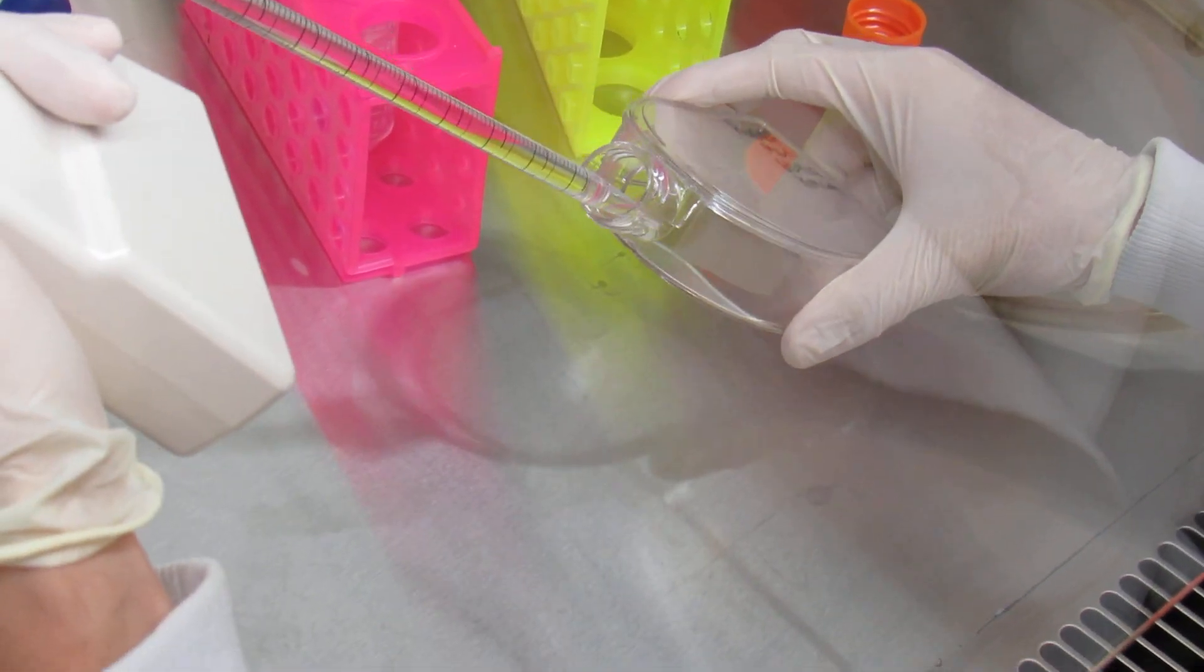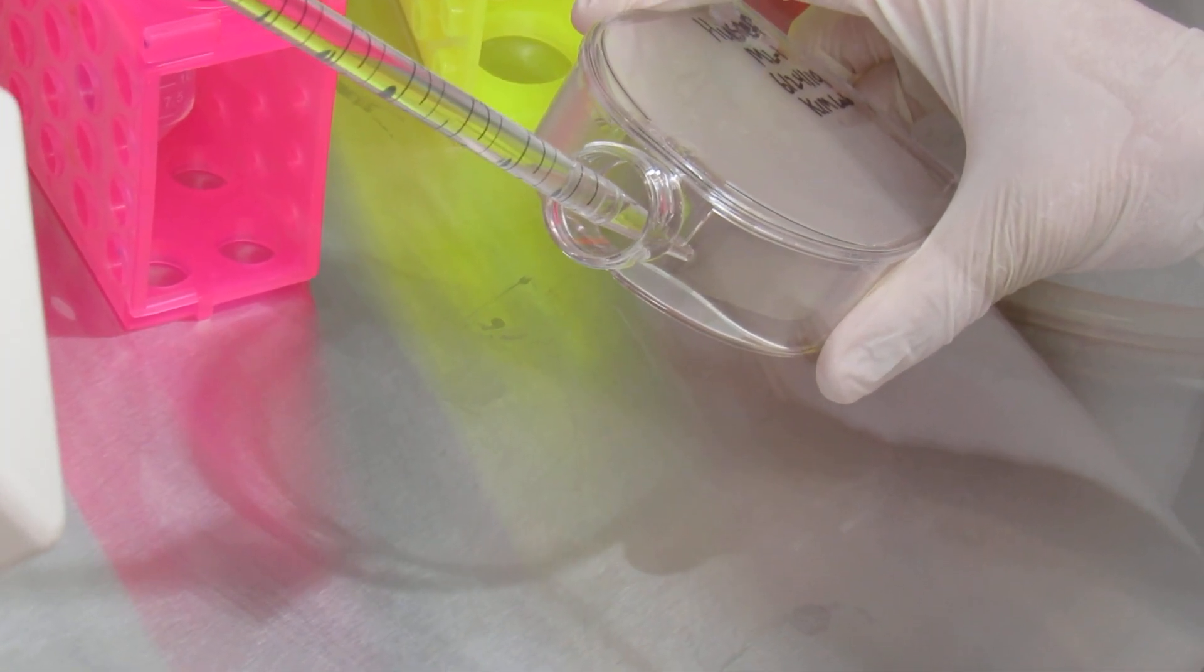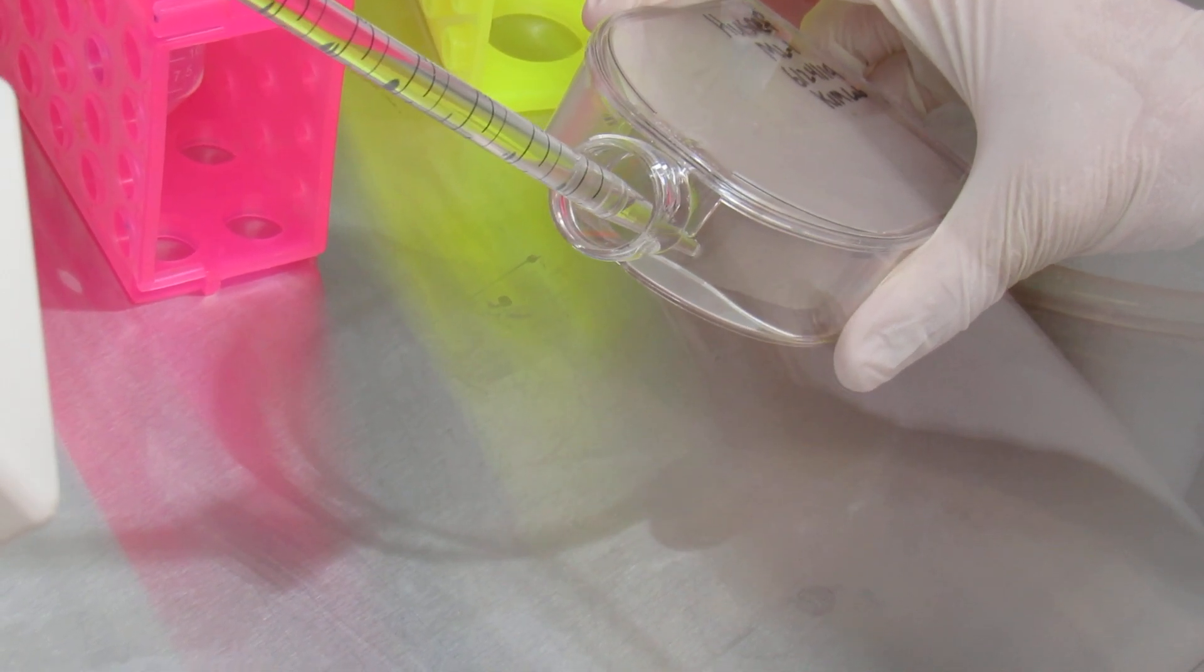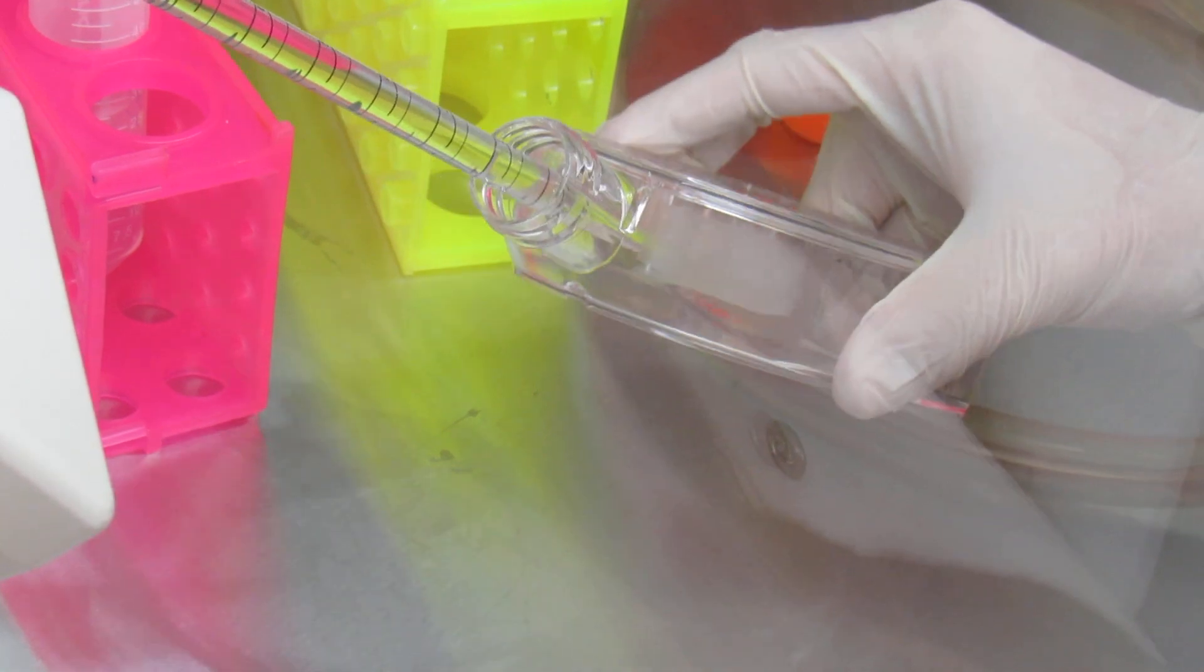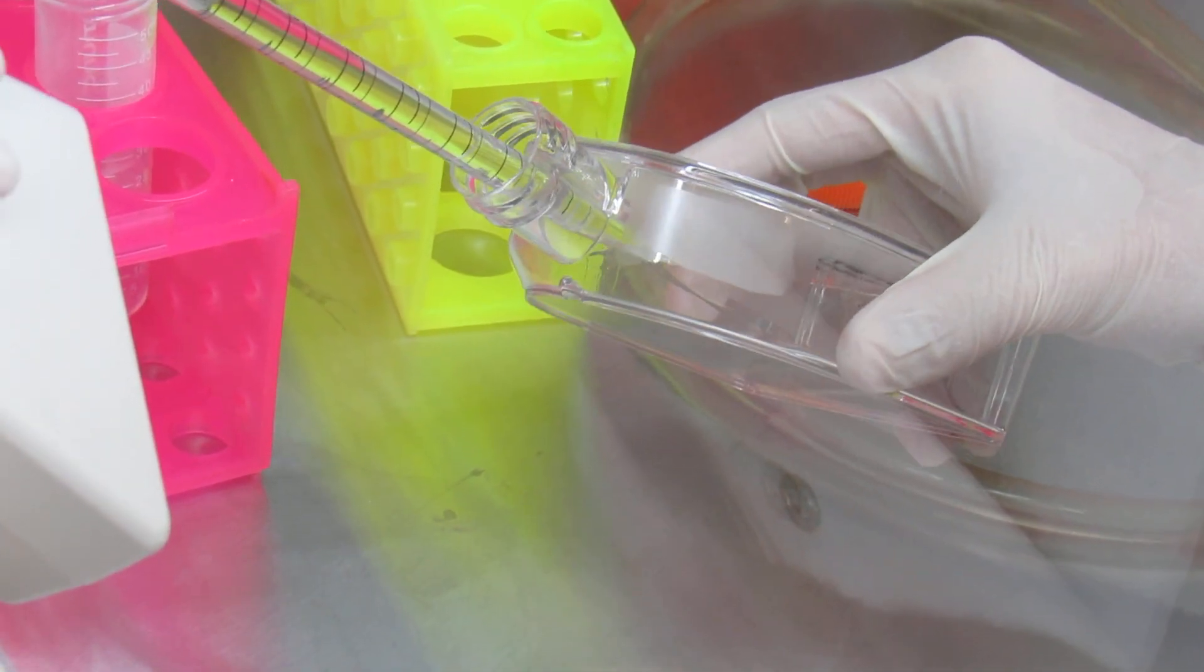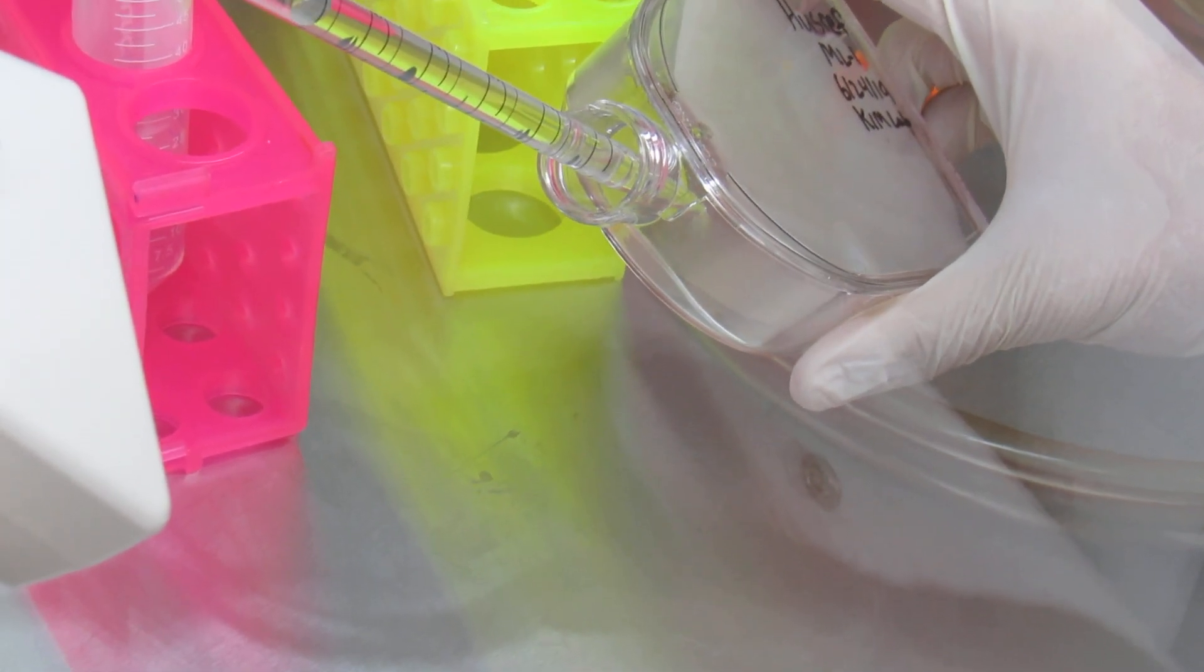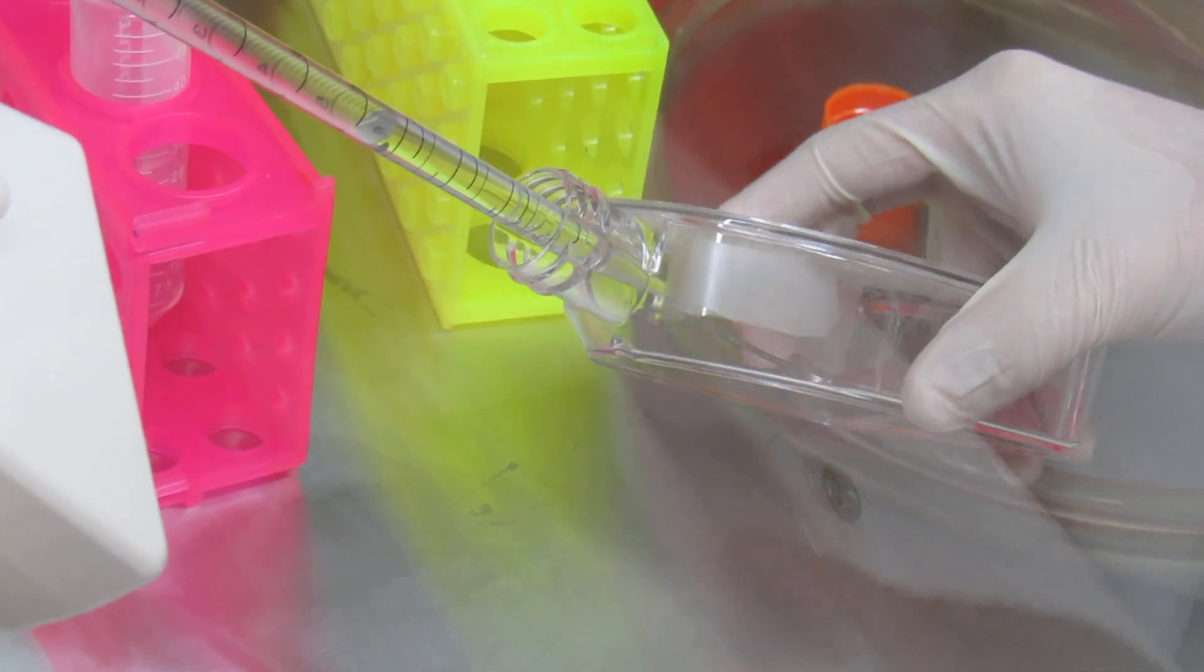Next, you'll add the PBS dropwise to your flask, again being mindful not to scrape the bottom of your flask. It may be a little hard to see, so rotate it so you can see it. And be very mindful whenever you're working with the pipette to never suck up any liquid past the maximum allotted amount, or you will contaminate the pipette as well as ruin the pipette filter.